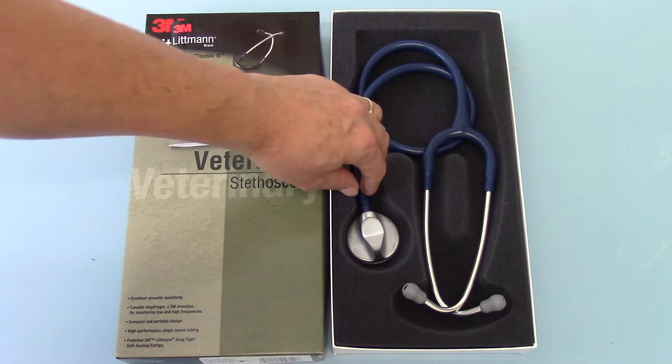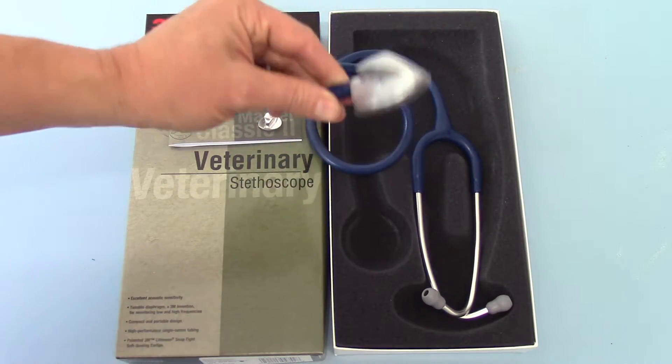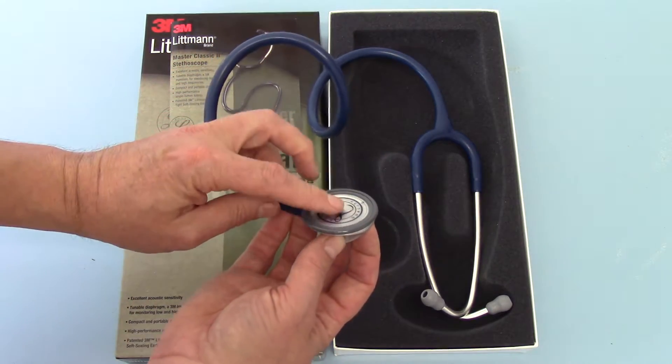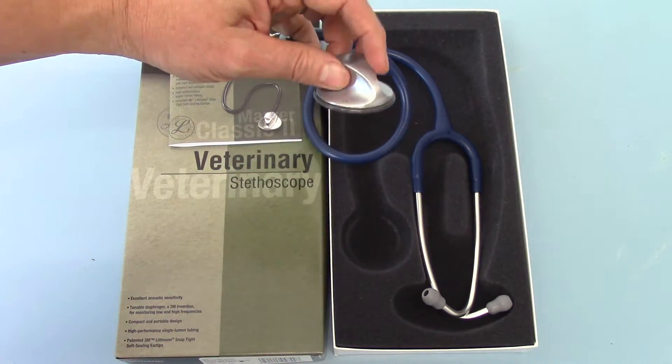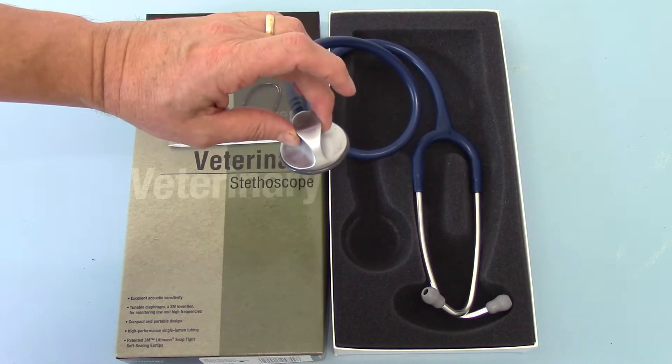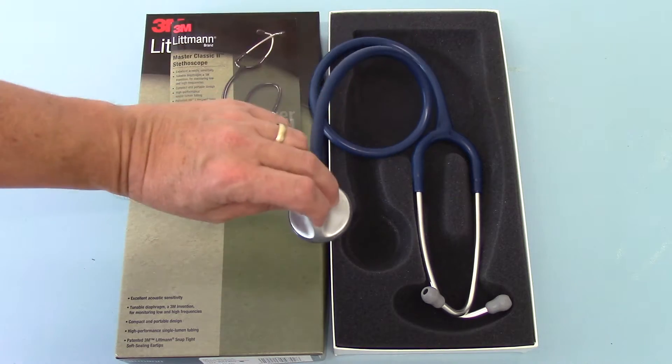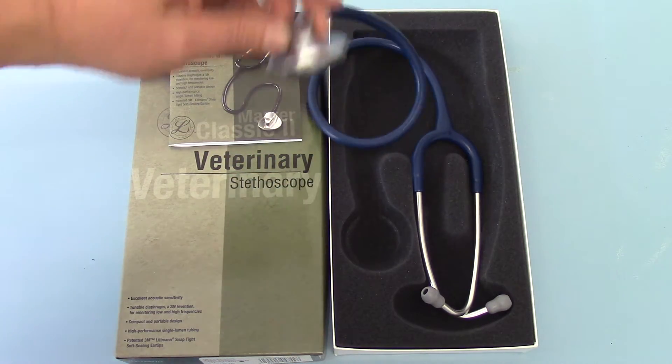Here we have the stethoscope. You'll see that this unit is a single-sided chest piece with a diaphragm, and the idea with this is that it's sensitive to pressure for tuning — so the harder you push, the different frequencies you'll hear with this unit.